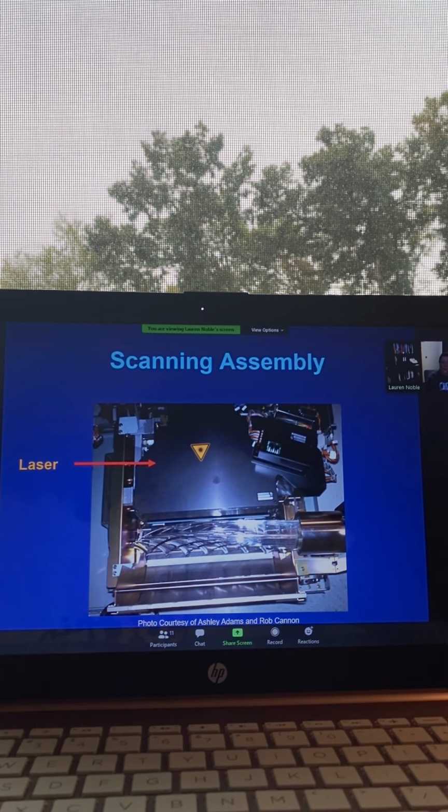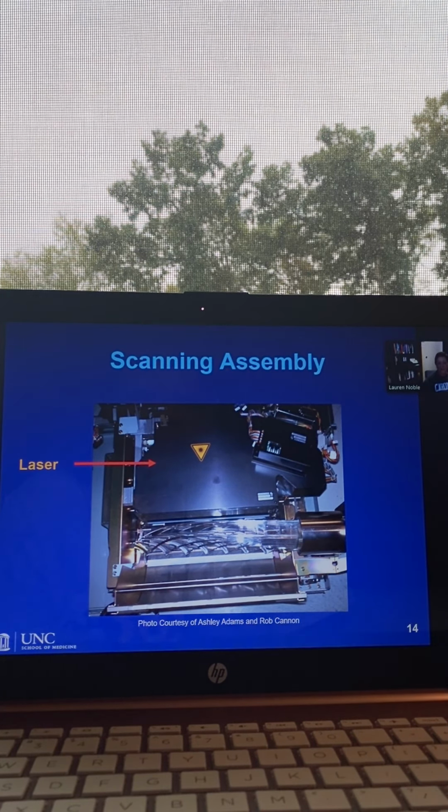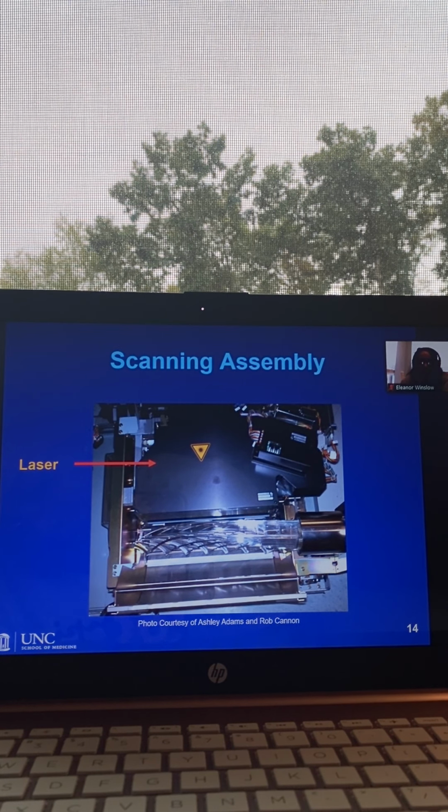All right. So far, to recap, the X-rays, we're talking about the PSP plate. When the X-rays come into the PSP plate, what is it that they are interacting with? Electrons. The X-rays, when they come into the plate, are interacting with the crystals.